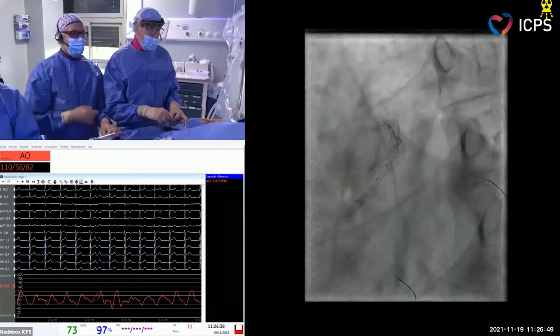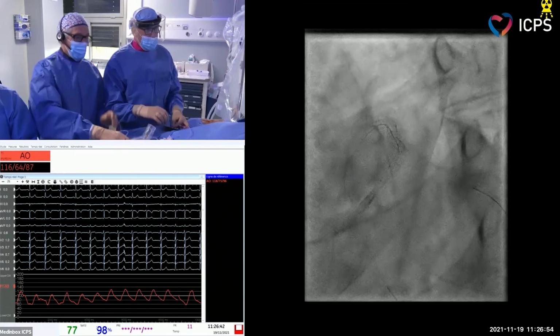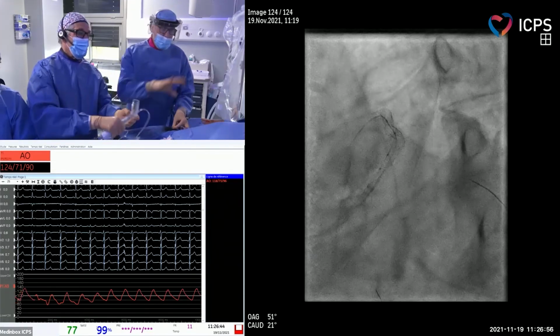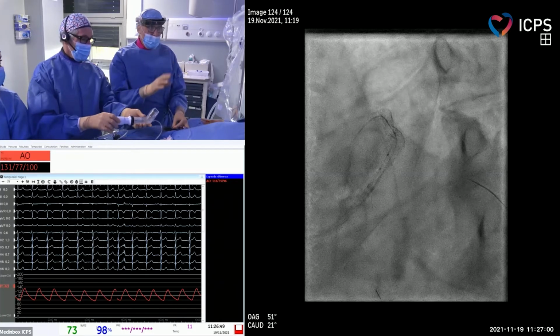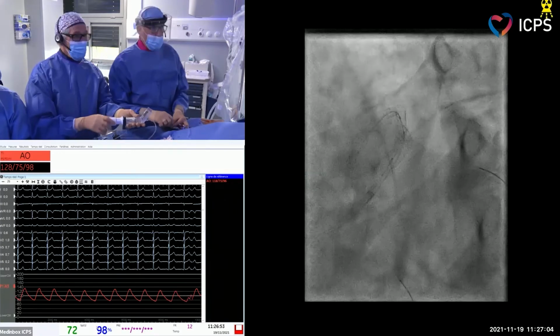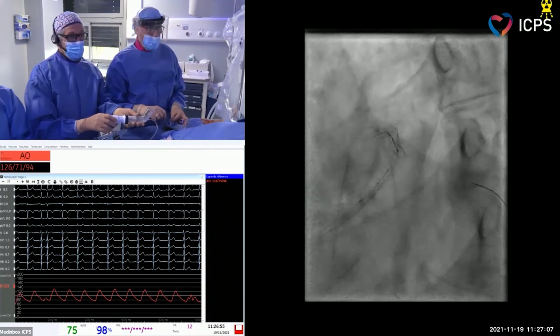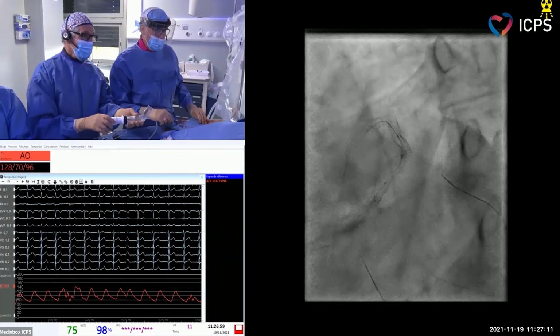And in this particular case, I don't know what do you think, but I think the view of the bifurcation and the position of the carena, there is no perfect view. Absolutely. So we don't know. Maybe there is a tight stenosis at the ostium. We don't know. Just because of carena shifting. Inflate the LAD, Thomas? Or no?